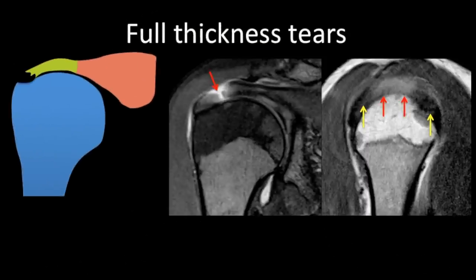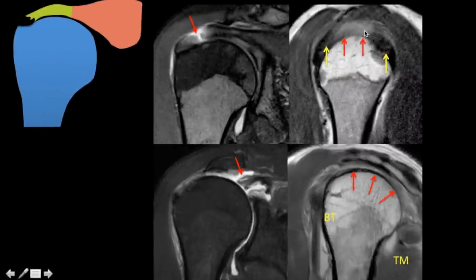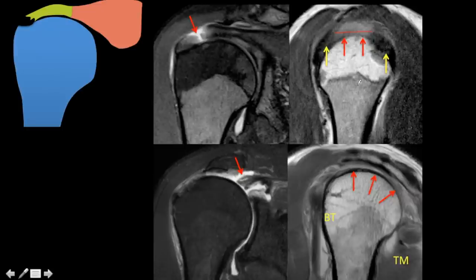Now we'll discuss full thickness tears. In one patient the enthesis is intact but there is a full thickness tear in the critical zone of the supraspinatus tendon with minimal retraction; the anterior-posterior dimension is noted on the sagittal image. In contrast, another patient has a full thickness tear from the enthesis with the tendon retracted almost to the glenohumeral joint; on the sagittal image the entire supraspinatus and infraspinatus tendons are not visualized, only the teres minor tendon remains. The anterior-posterior dimension of the tear must be measured and reported.